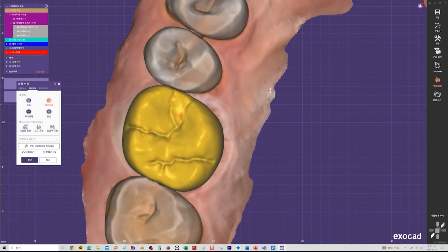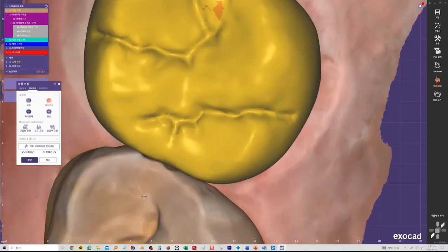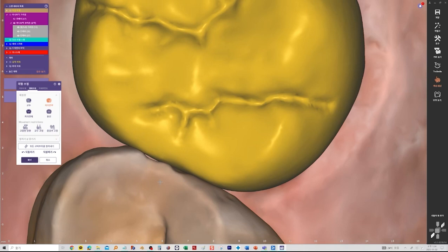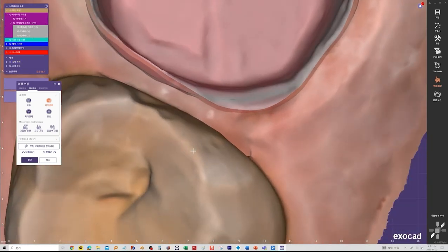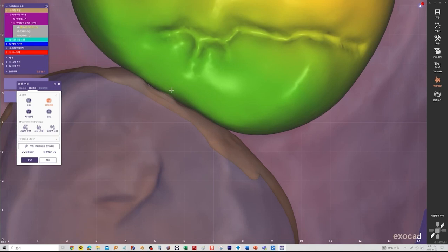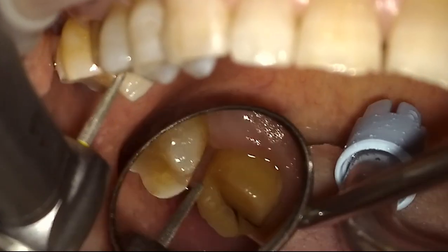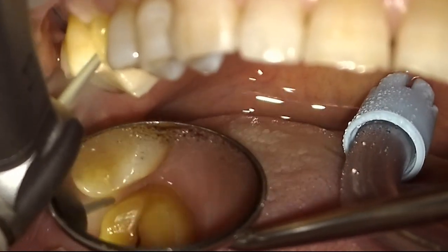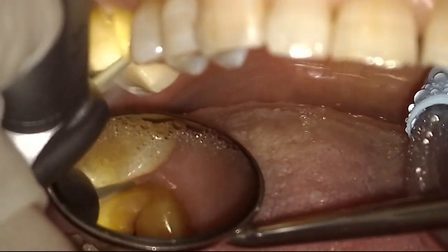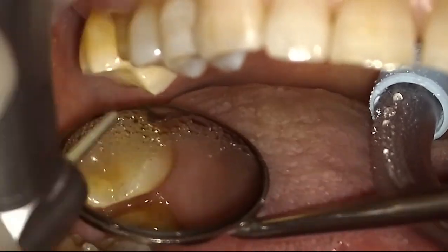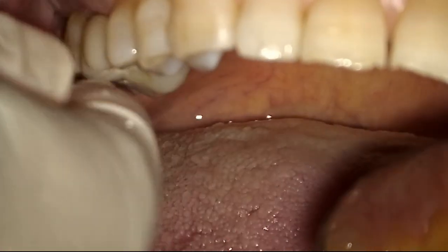In the picture, you can see that the adjacent surface of tooth number 17 is uneven. The technicians are supposed to notify me when this happens. Here I am correcting the design myself. I'll remember this and use it as a reference to trim the teeth during crown delivery. In the end, it turned out well.